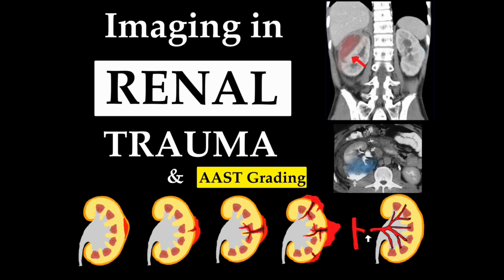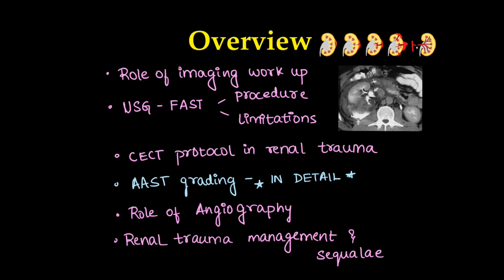In this video, we'll see in detail about imaging in renal trauma, how to approach a trauma patient from the initial ER till the management, and also AAST grading recent updates.